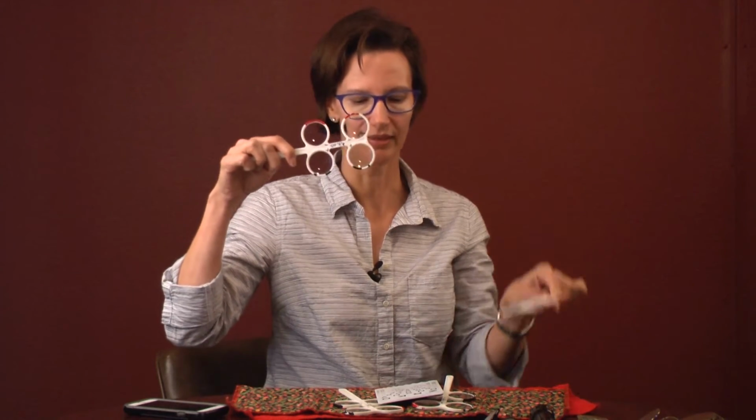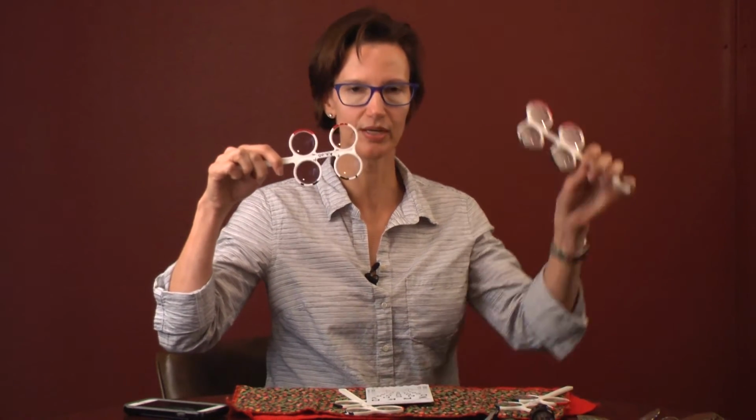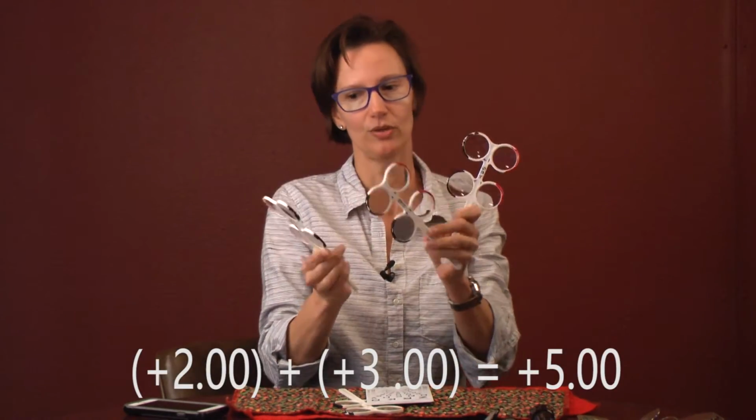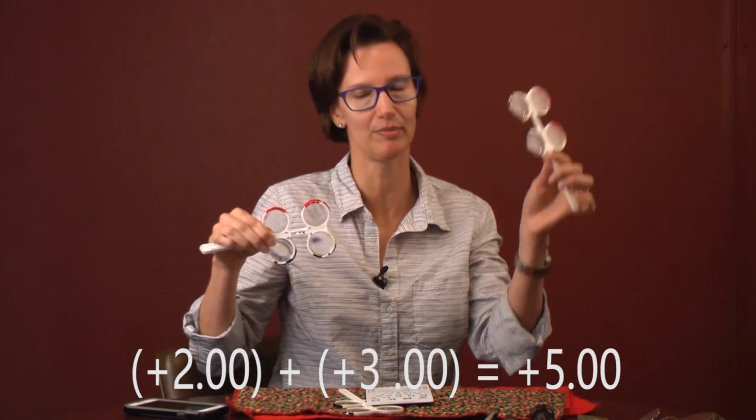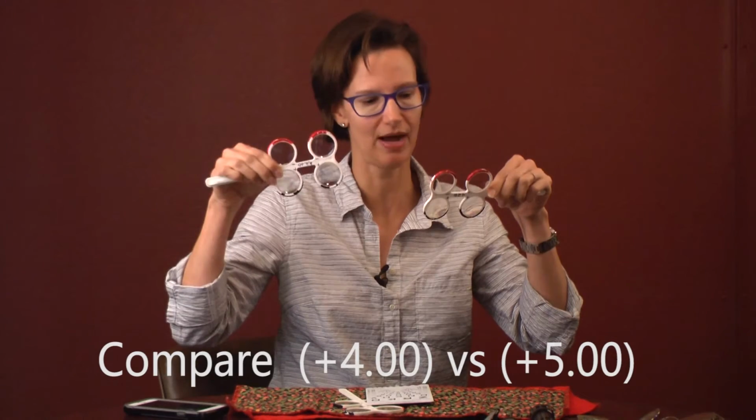So I'll compare the 2 to the 3. If they like the 3, I'll go to the 3 to the 4. If they like the 4, I add the black +2 with the black +3. Now that gives me 5, and I'll compare the 4 to the 5.